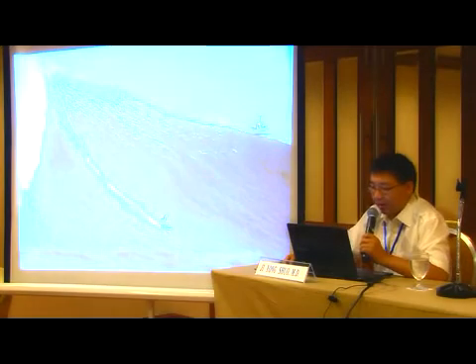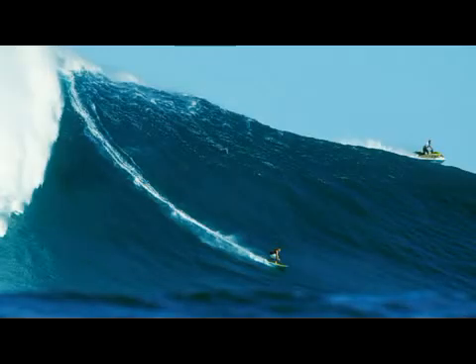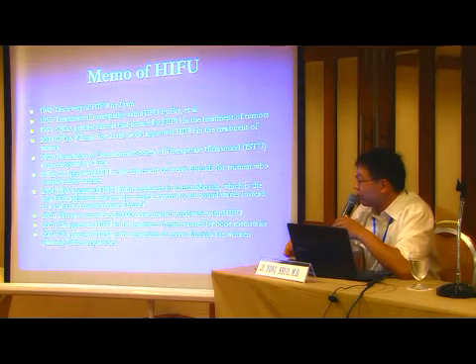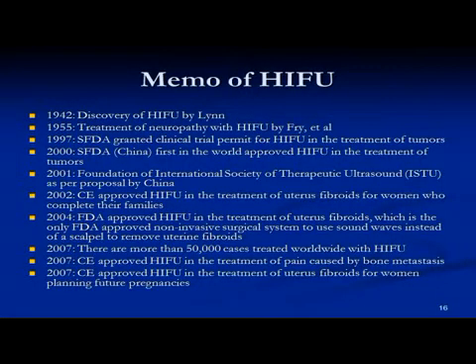Let's look back at the development history of HIFU. In the 1940s, the assumption was put forward, and in the 1950s, it was used experimentally in brain disease. And the year 2000 was crucial. China was the first in the world to approve HIFU in the treatment of tumors, and ISTU was held in the next year. In 2002, CE approved that HIFU can be used in the treatment of uterine fibroids for women who refused childbearing again.